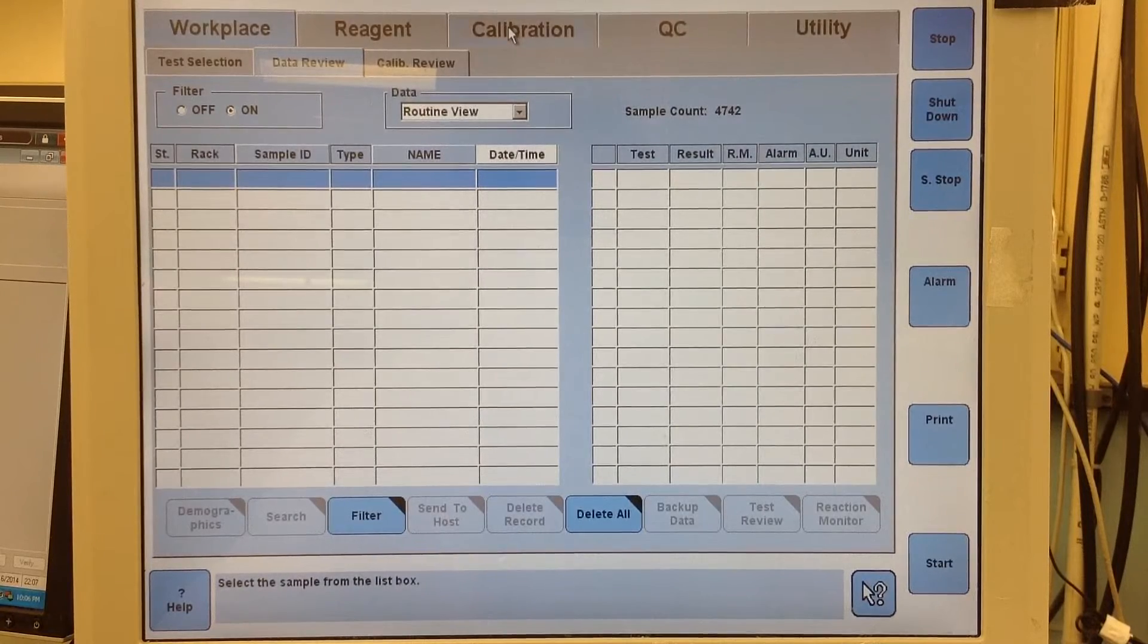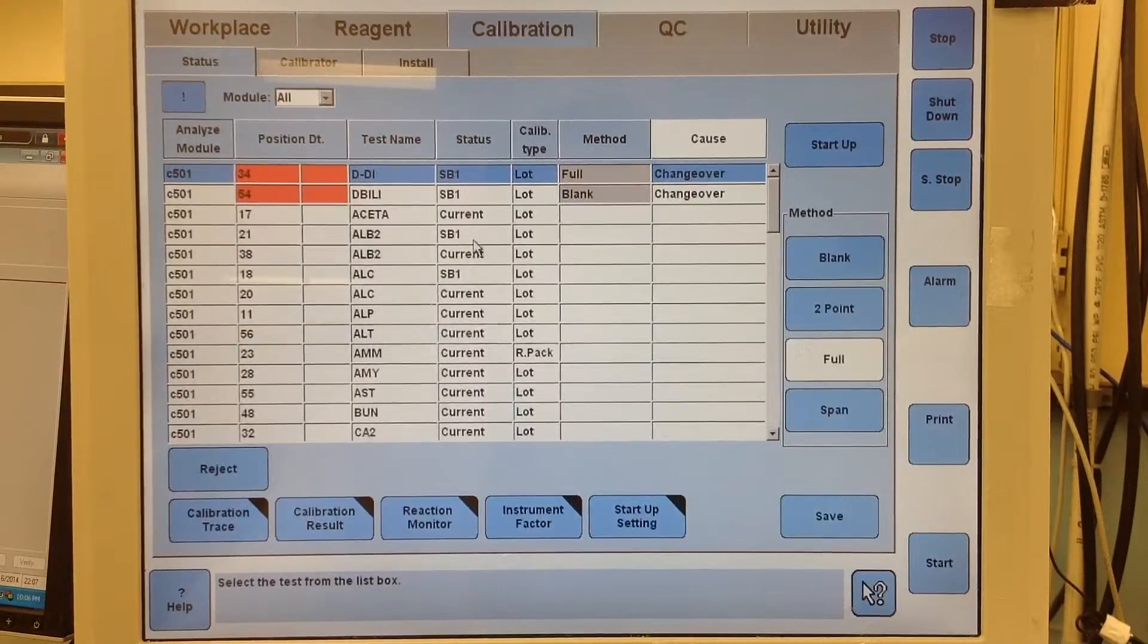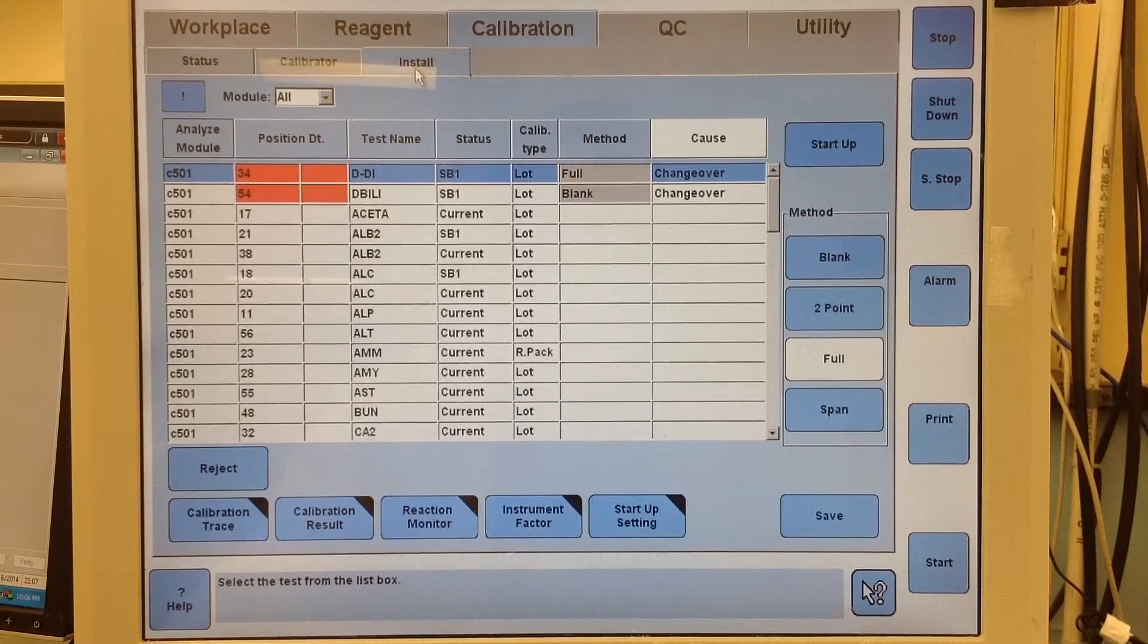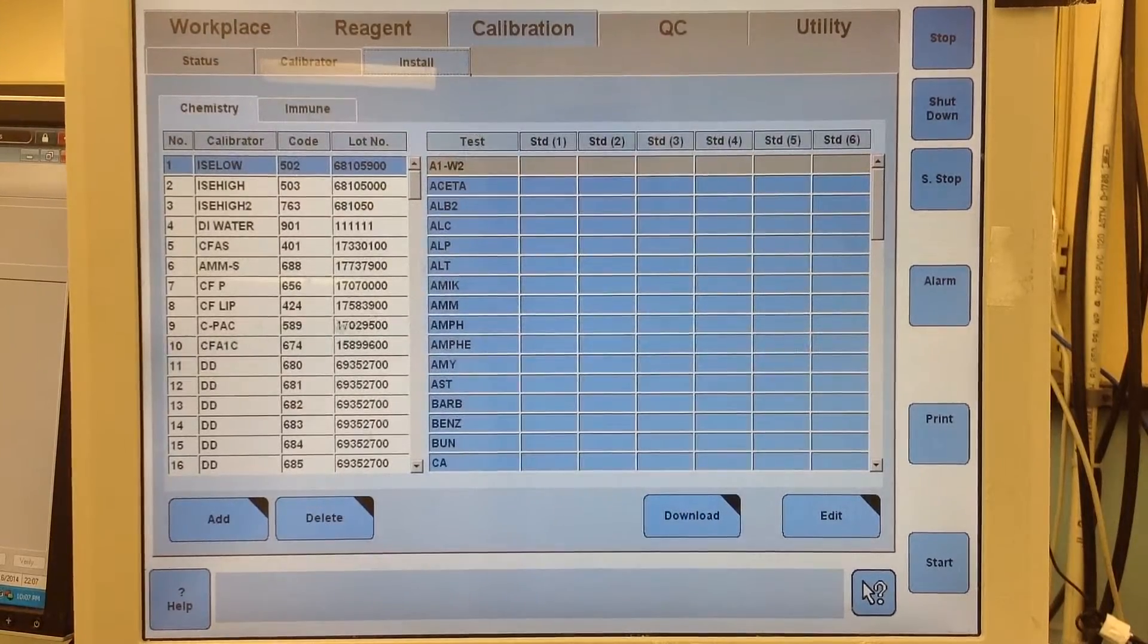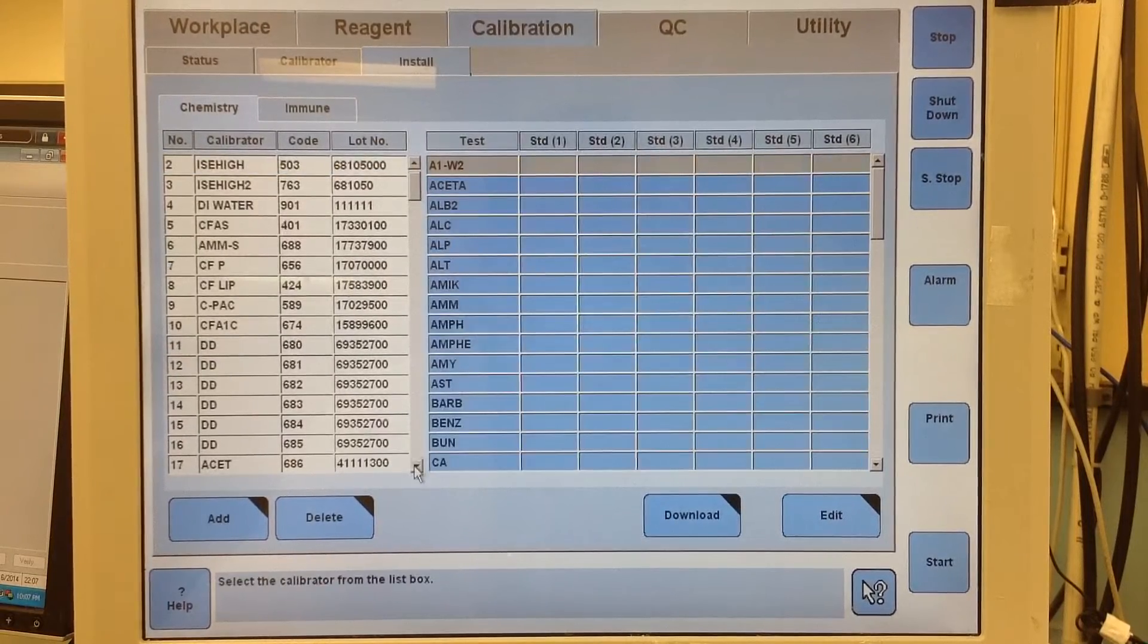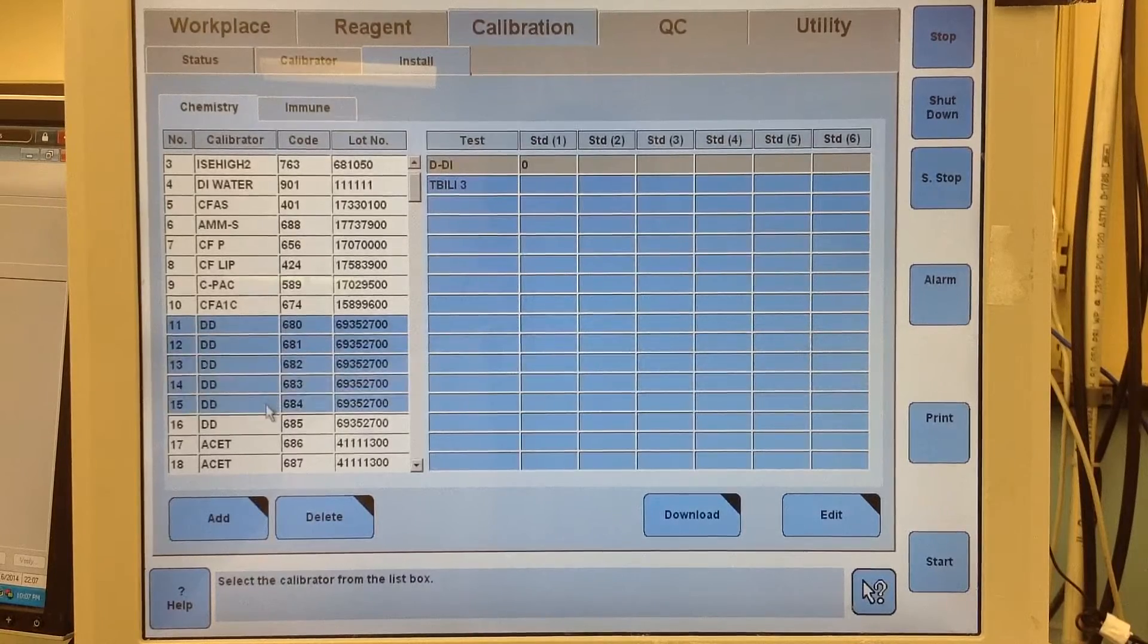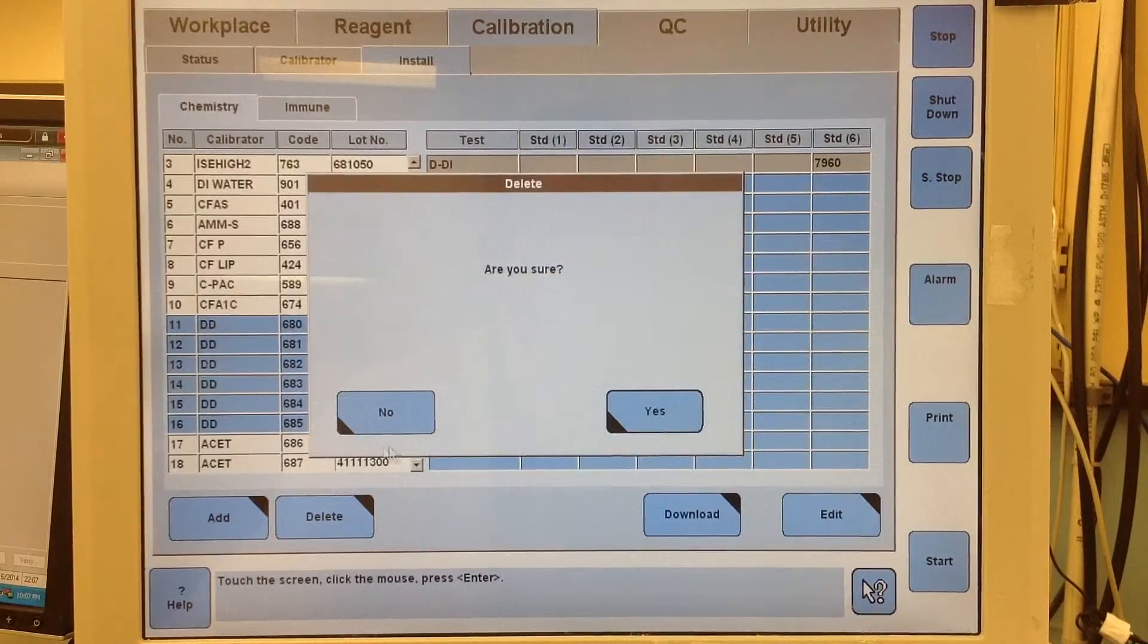To do a calibrator you need to go to the calibration tab. I need to do the D-dimer but it's a new lot. Then we're going to go to install. I'm going to scroll down and delete the previous spots that are containing my D-dimer calibrator. Go to delete.